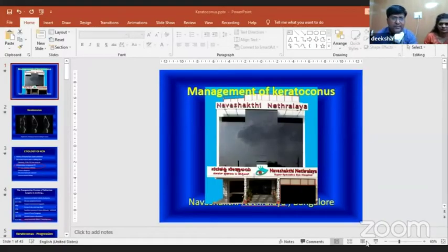Thank you for the wonderful presentation, Deepthi. To add a few more points, I would like to see the ART max, the Ambrosio relational thickness, for keratoconus screening. Anything which is less than 330, I consider it as a keratoconus. 330 to 380 is suspicious, and more than 380, almost no keratoconus. And also the progression index, which helps in screening for keratoconus.